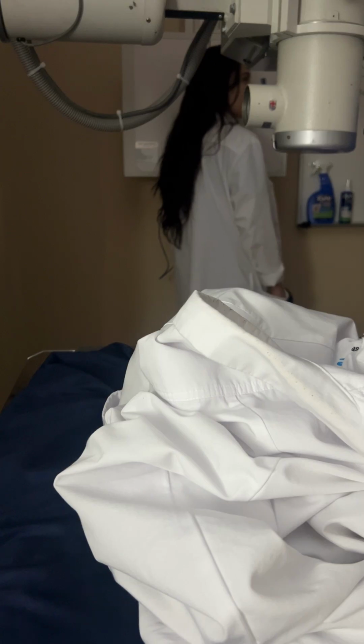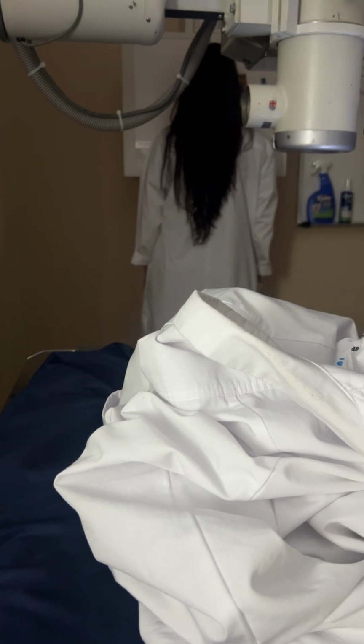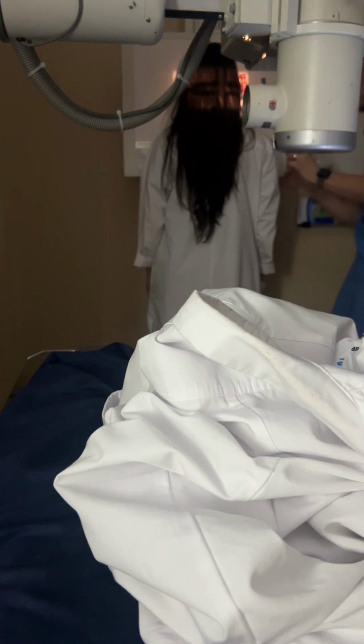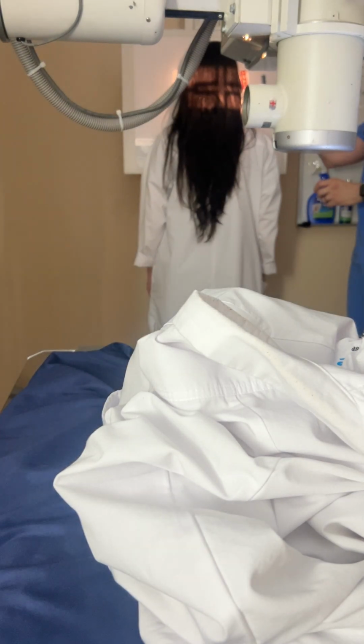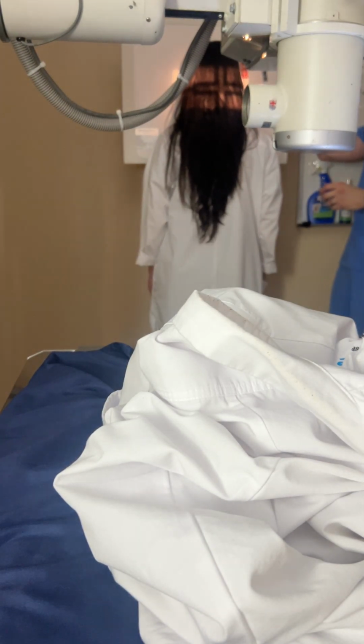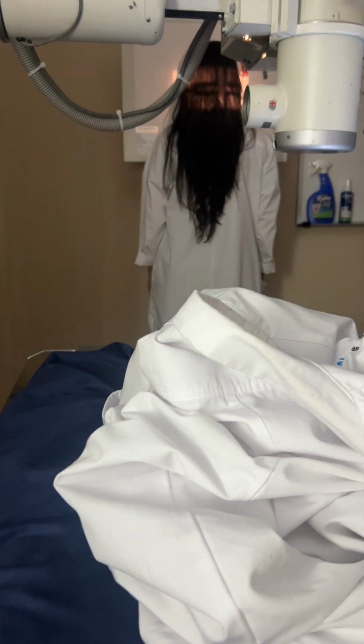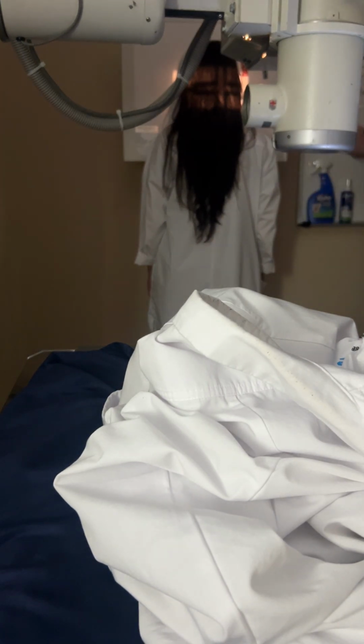So the OML, I was right. OML is going to be perpendicular to the IR, so lower your chin for me just a little more. Great. And watch your nose. I'm going to bring this up. And your CR is perpendicular to the mandibular region. They got really specific with this one.